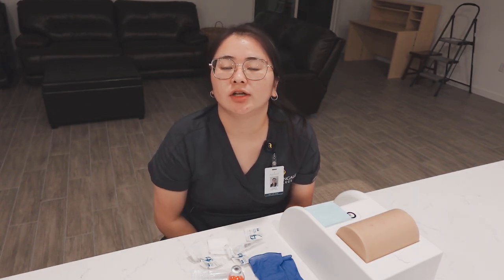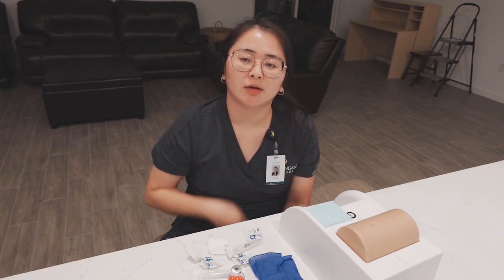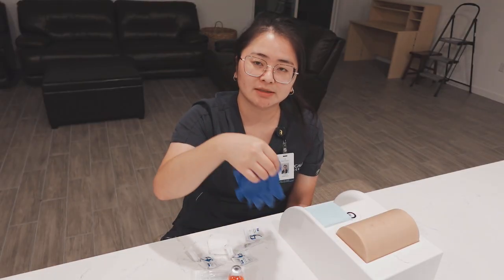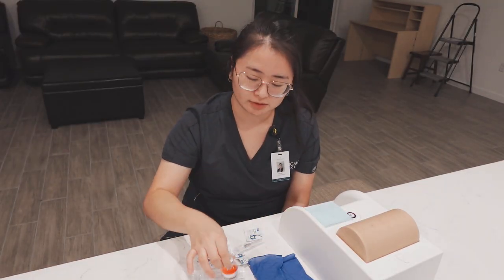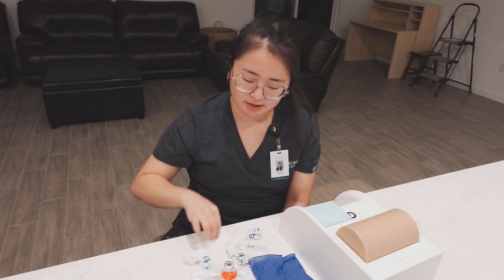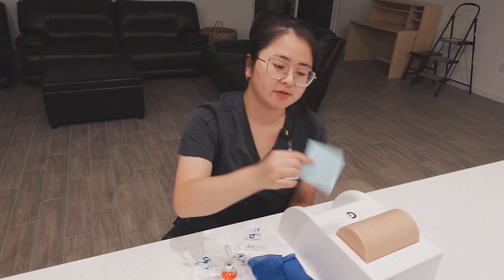I'll be doing the skills video administration of intramuscular injection. I'm wearing the correct uniform. I have my badge. I have all my supplies. My supplies consist of a pair of clean gloves, my vial, 3 alcohol pad swabs, gauze, and I do have this post-it.